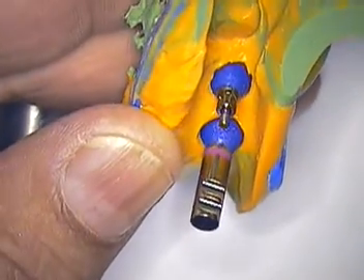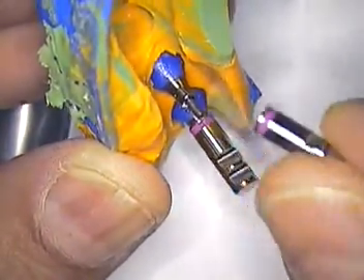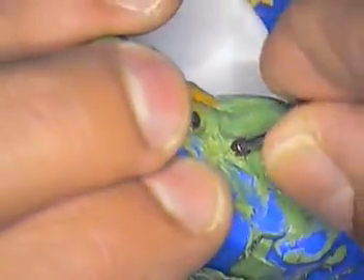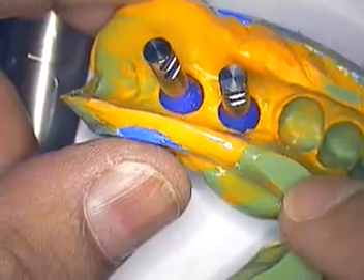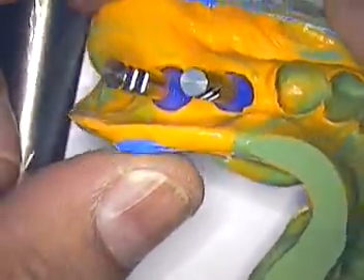This is a Strauman bone level case and this is their analog — it's an RC, color coded magenta. We're going to go ahead and tighten that up. The reason I'm giving you this video is for those who have called in and written about the difference between a tissue level and a bone level type of implant, and also the use of a surgical stent. This particular case brings out a number of issues.